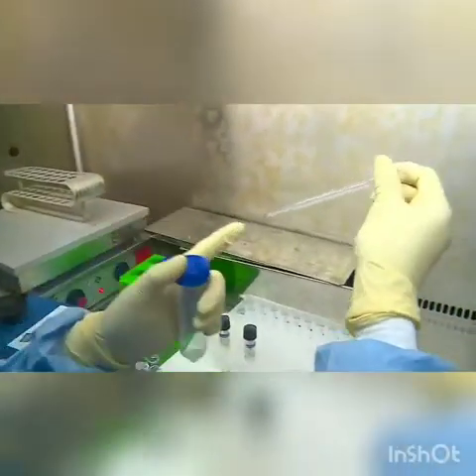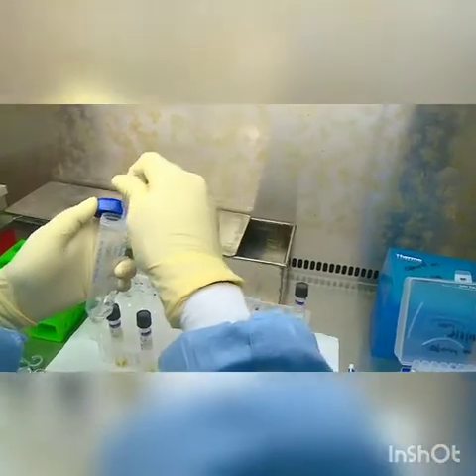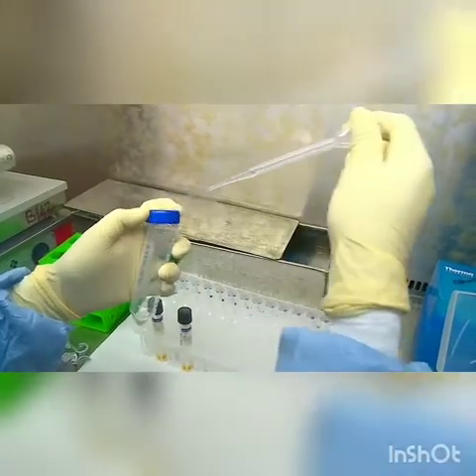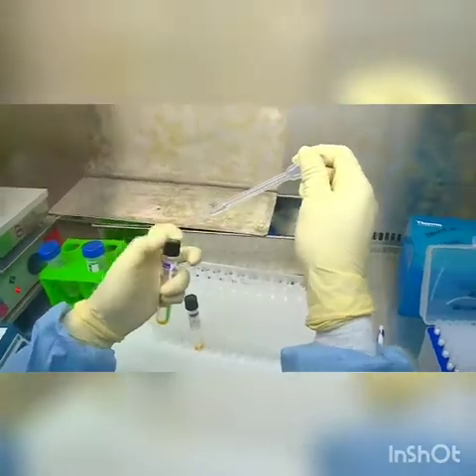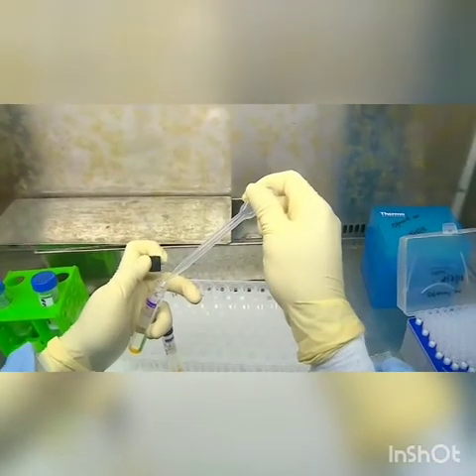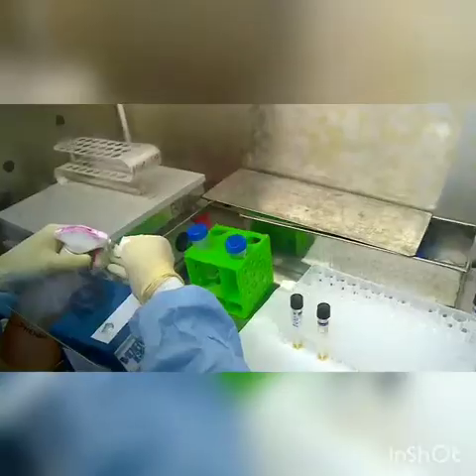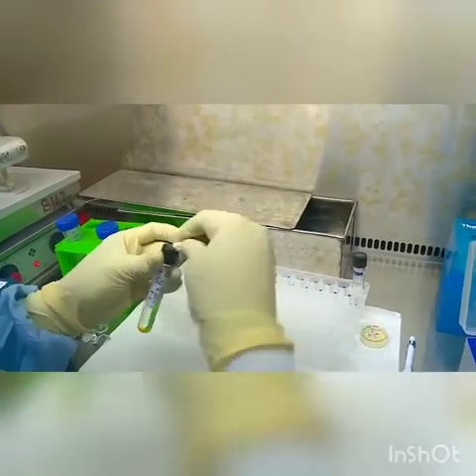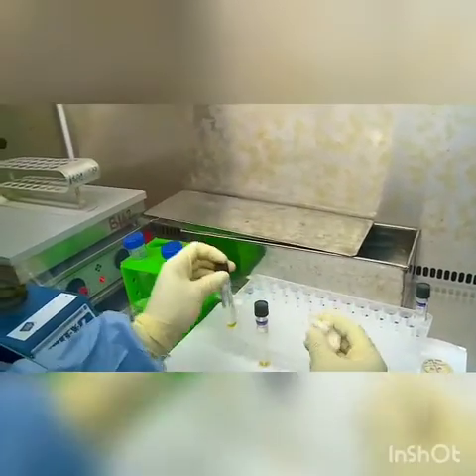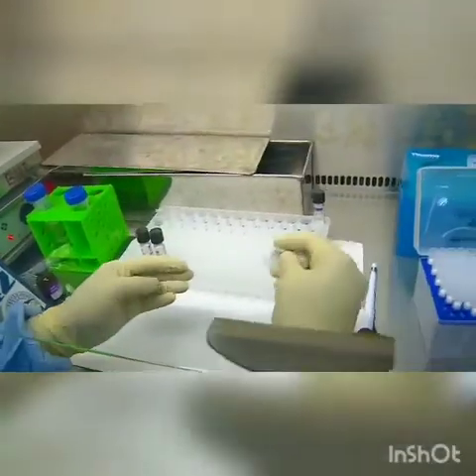Mixing well ensures that a uniform deposit is added to the tube. 0.5 ml is taken using a sterile Pasteur pipette up to the 0.5 ml mark and carefully added to the MGIT tube. The pipette is discarded in the disinfectant bath. Once both tubes are inoculated, before removing them from the biosafety hood, the external surfaces of the tubes are wiped with disinfectant.